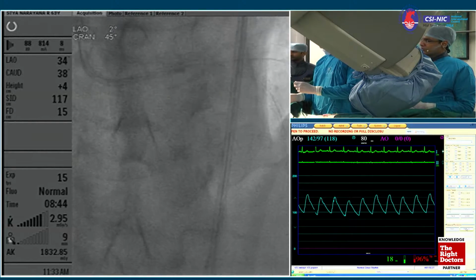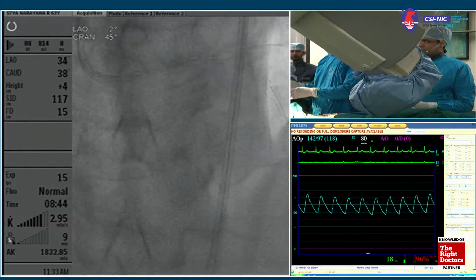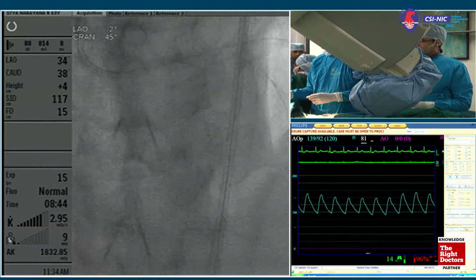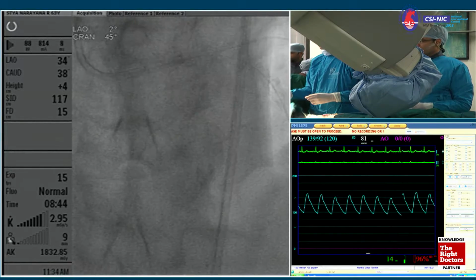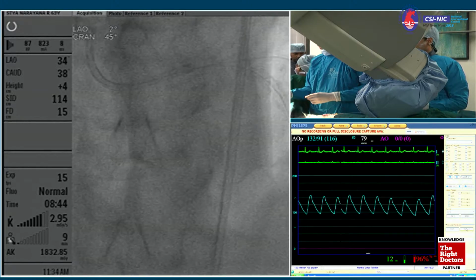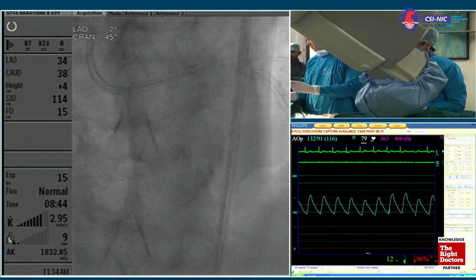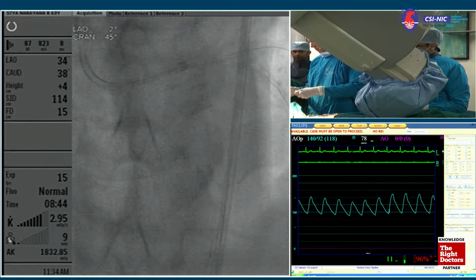Yeah. You know, this is a trifurcation of LAD, then there's a left main disease, then the circumflex is arising at 90 degrees. Yeah. And there is at least a 15% chance that he will develop stenosis of the circumflex ostium after the stenting. True. We know that, we have the experience. So this patient, certainly my choice will be surgery. For the previous case, Dr. Seth's patient, I will prefer angioplasty. Why? Because LAD is diffusely diseased.